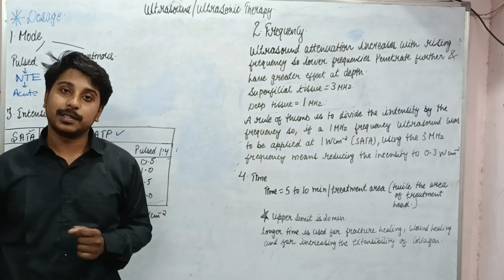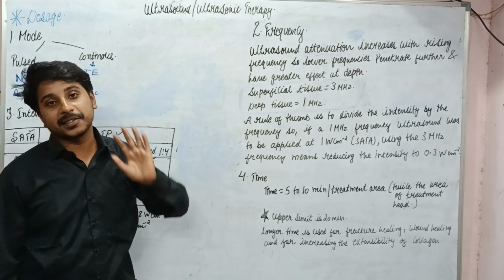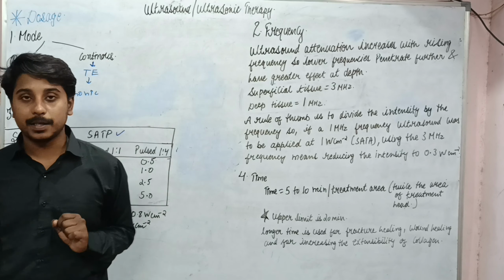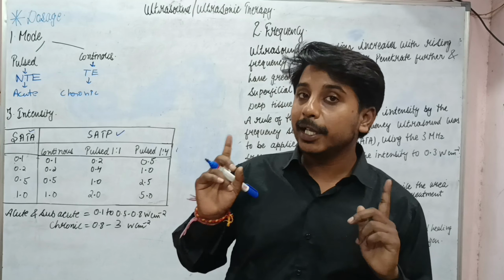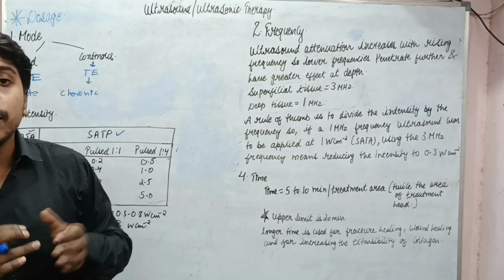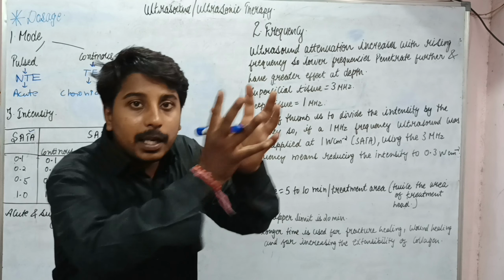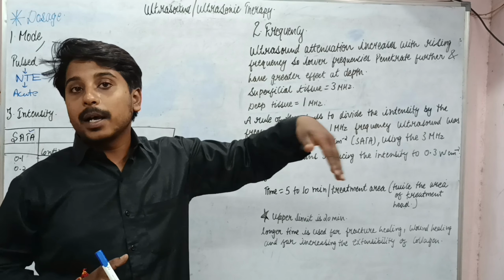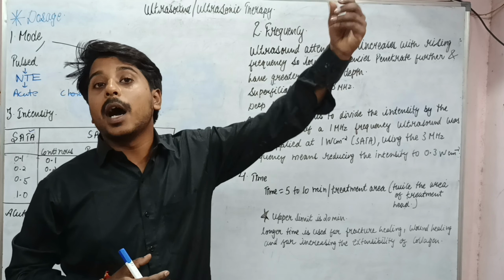Next is frequency. This is very important, and there is something interesting in understanding the dosage regarding frequency. In my lecture on electromagnetic radiation, we studied different radiations, moving from lower frequency toward higher frequency, that is gamma rays and X-rays, which are at a very high frequency.